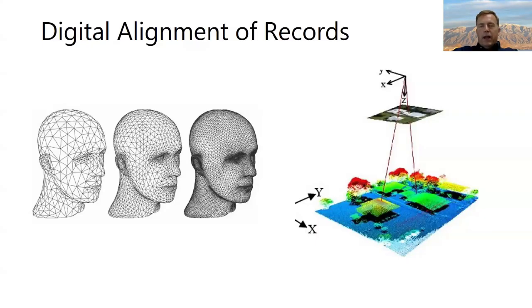So why do we care? As we're going through this workflow, we're going to be talking a lot about taking different scans and how we'll be aligning them to each other. You'll find that at times we're going to be taking scans, for instance, on the day of surgery, we'll take our first scan. We're not going to ever make anything on that scan, but it's a critical scan for getting alignment to the preoperative and the postoperative situation.